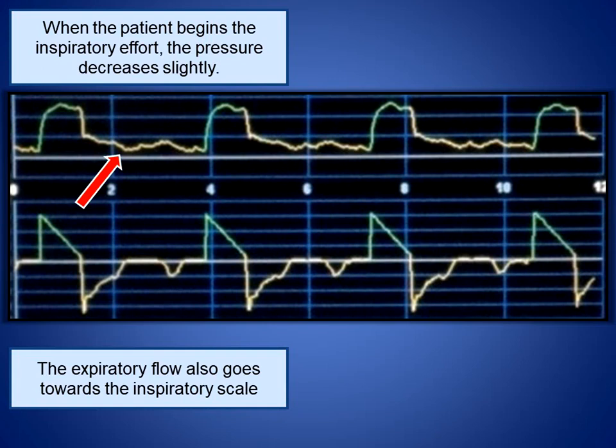the airway pressure. I will caution here, though, that this can be a little tricky sometimes because of the vertical axis and how essentially zoomed in you are on that. I have this vertical axis pretty tight so that I can show you this. However, sometimes, depending on how zoomed out you are, that line will be pretty flat and you can't depict whether there's a decrease in airway pressure. So that's my only cautionary tale about just using that airway pressure.